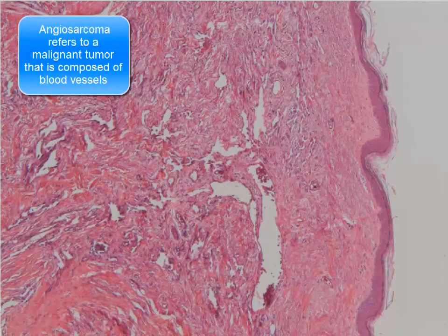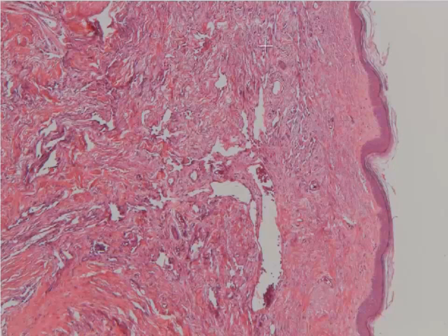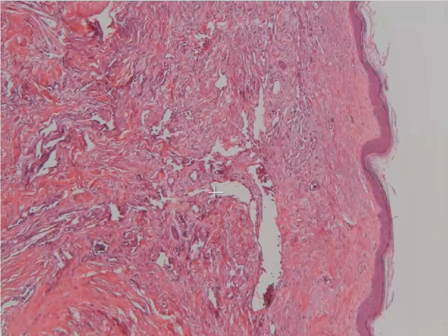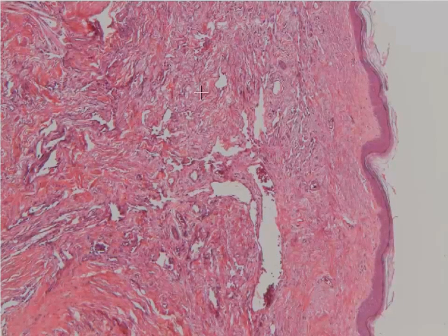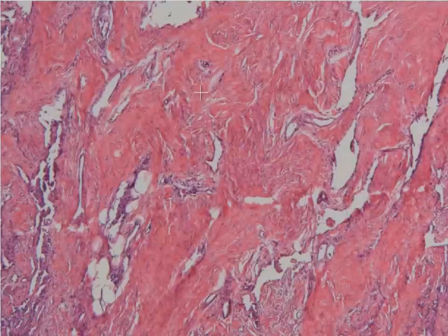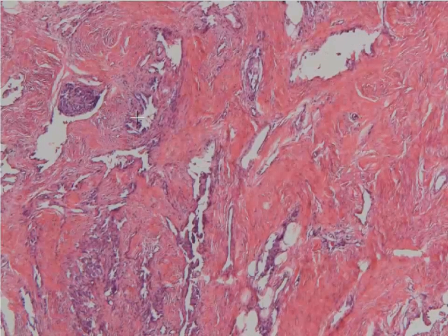In this first case you can see that we're dealing with the skin. We have epidermis and underlying dermis, and you'll notice that even at low power you can see some atypical vascular spaces permeating through into the dermis. These spaces continue as you go into the deep dermis.